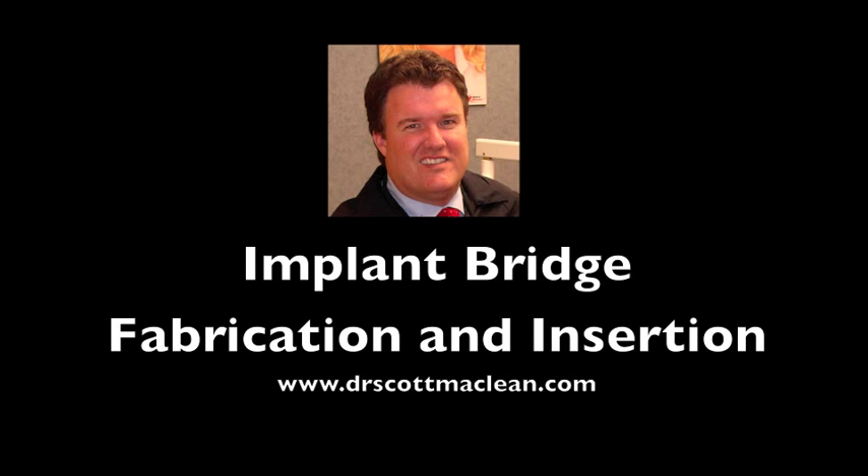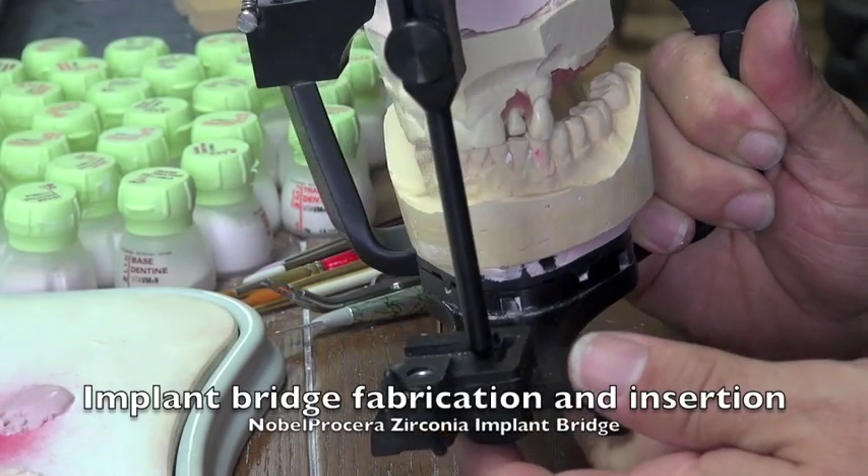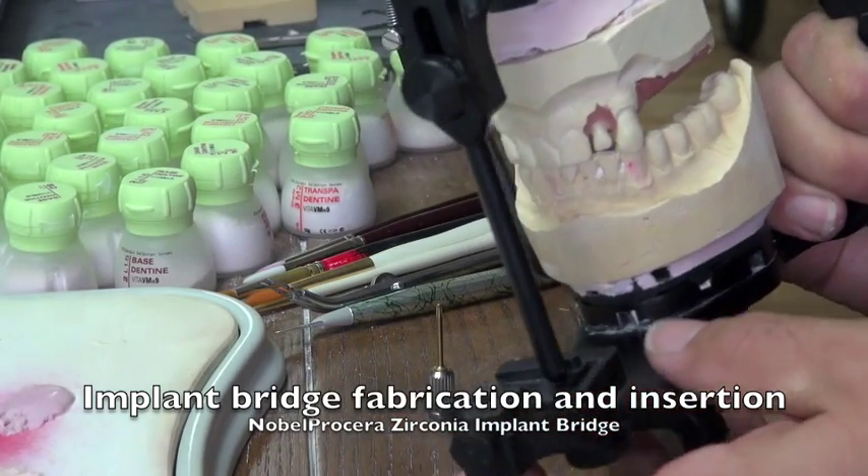Hello, this is Dr. Scott McLean and this is a YouTube video about implant dentistry. Today we're going to be fabricating and inserting an implant bridge made out of zirconia.